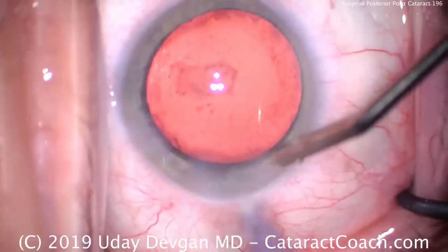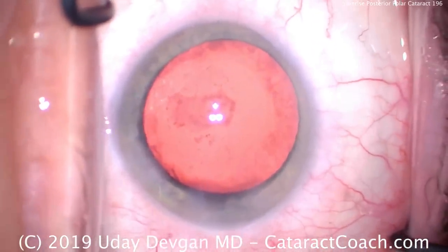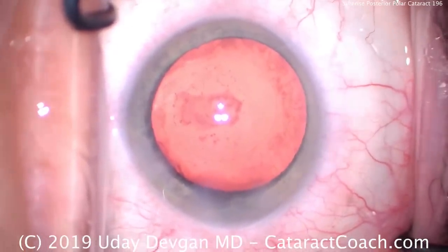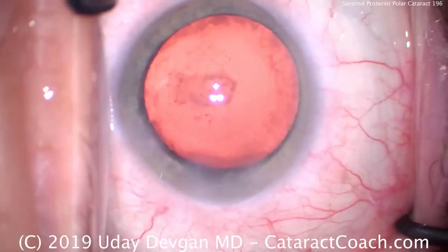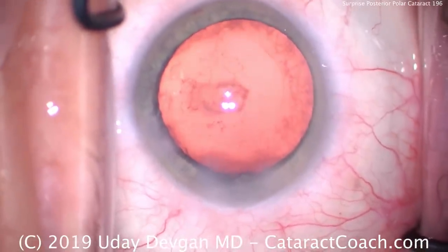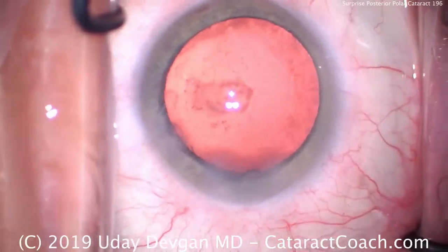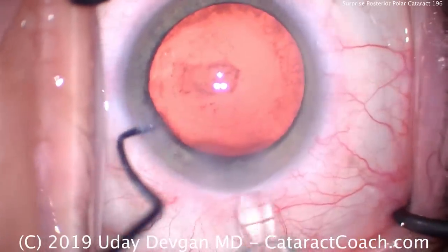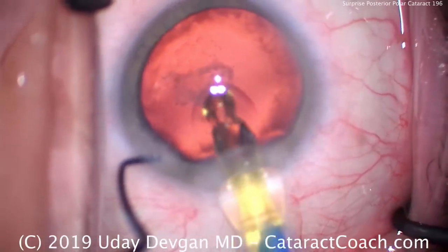Now it looks pretty good. We're going to open up our single-piece acrylic lens. What are the lens options? You could put a single-piece acrylic lens in the bag, which is what we're doing here. You can also put a three-piece lens in — a three-piece lens is nice because you have options. If the posterior capsule breaks when you insert it, you can put the three-piece lens in the sulcus or opt to capture it. However, if you're putting in a single-piece acrylic and you break the capsule, you have to take the lens out.